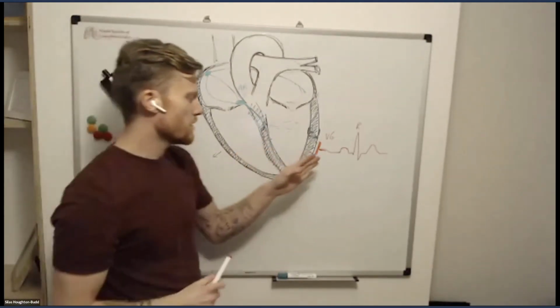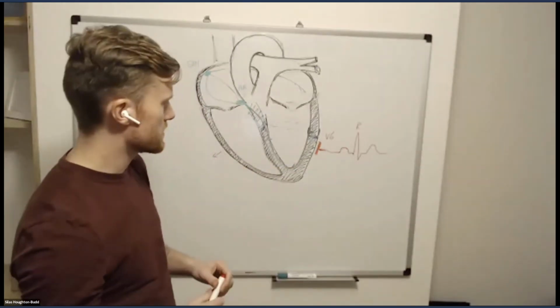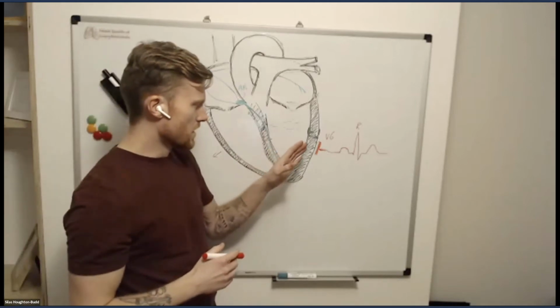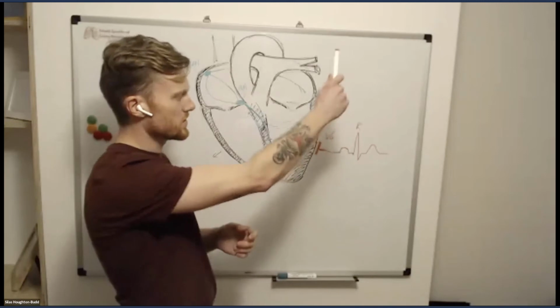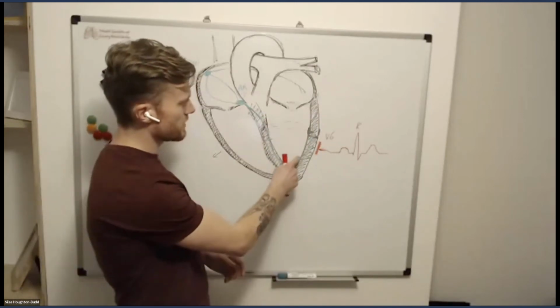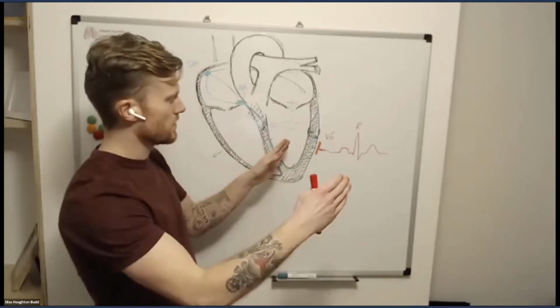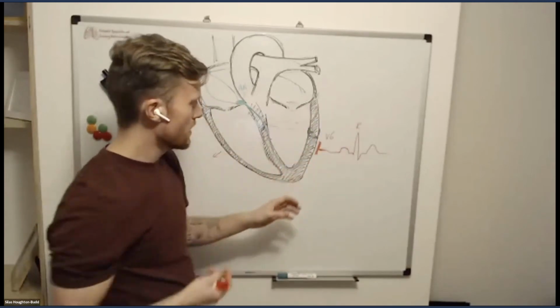So the thing to understand about a T wave and why it's positive is important. We know that electricity traveling towards an electrode causes a positive deflection on the ECG. And so in normal physiology, when electricity is released into the endocardium and moves out to the epicardium towards the electrode, we get a positive spike.